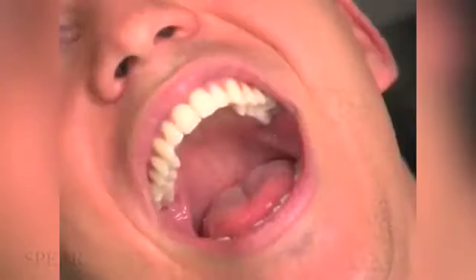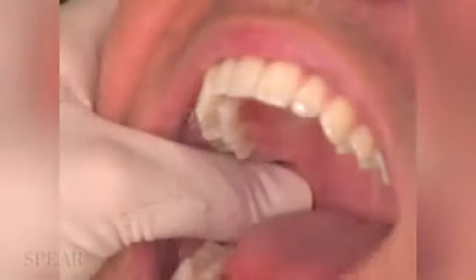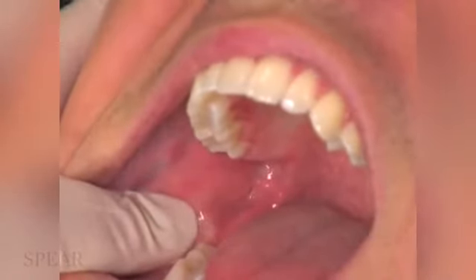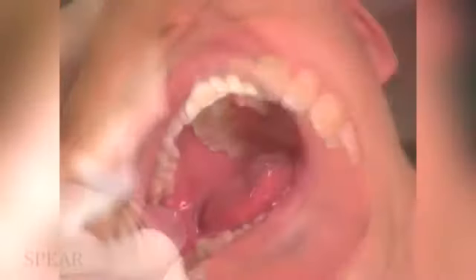So now we're going to show you video of the inferior alveolar nerve block followed by the long buccal. A finger is placed on the lingual aspect of the ramus and pulled anteriorly until the coronoid notch is palpated. The coronoid notch is the greatest concavity on the anterior border of the ramus.